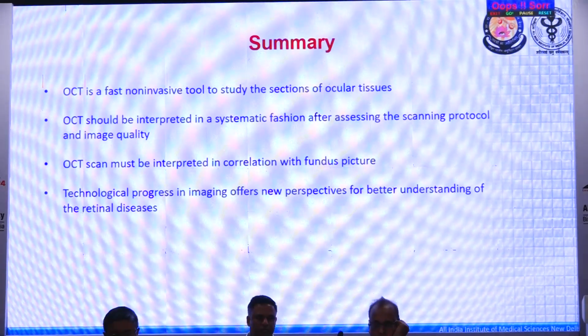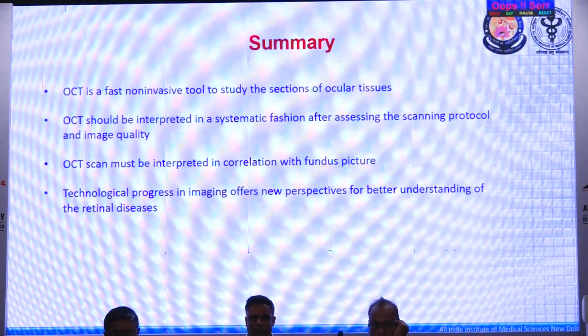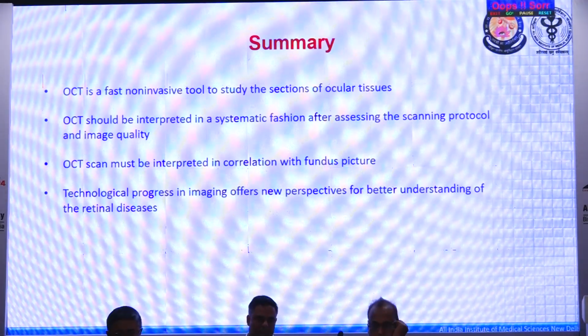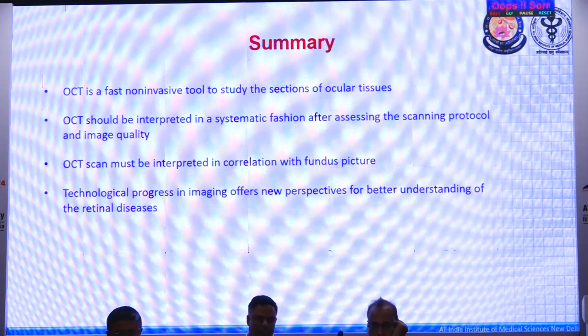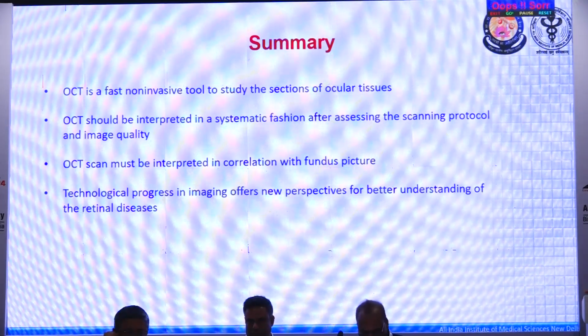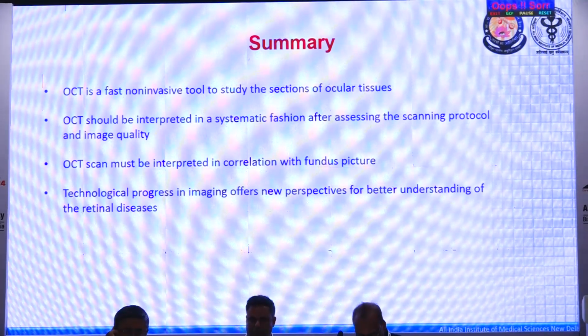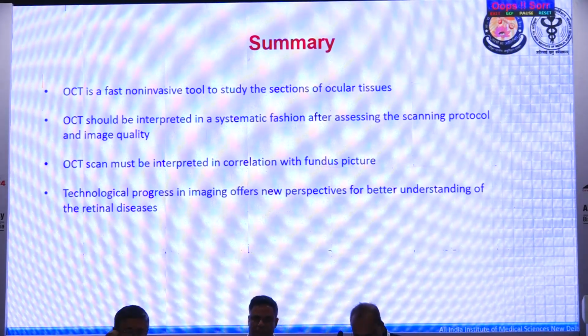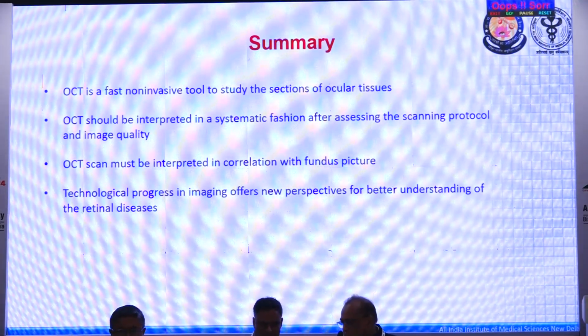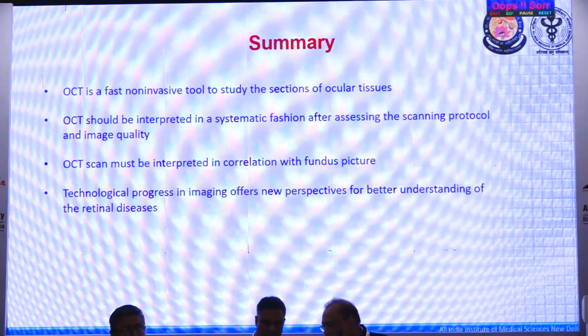To summarize, OCT is a fast, non-invasive tool, and it can be used to section any part of the ocular tissue nowadays, and it should be interpreted in a very systematic fashion. You should focus on the scanning protocol used and the imaging quality. It should always be interpreted in correlation with the fundus picture, never alone. And with technological advancement, newer and newer types of OCT modalities are coming up, which is helping us in better understanding of ocular diseases.